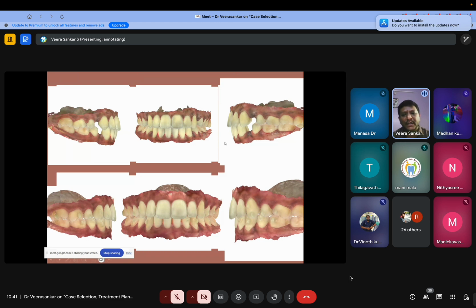After the aligner treatment was initiated, this is after 8 months. The space has been closed completely. The midline shift that was complained about by the patient is corrected. She was very happy because the treatment was completed without any disturbances or discomfort, and it was very fast. And she visited here only one time after the treatment was initiated. She is very much satisfied.